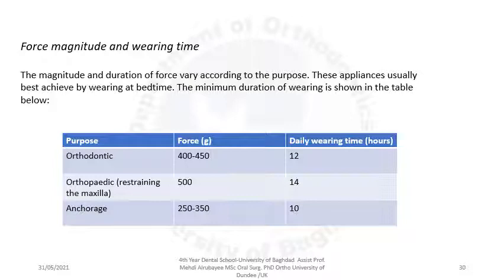Force magnitude and wearing time of the headgear. The magnitude and duration of the force vary according to the purpose. These appliances are usually best worn at bedtime. The minimum duration of wearing is shown in the table below.